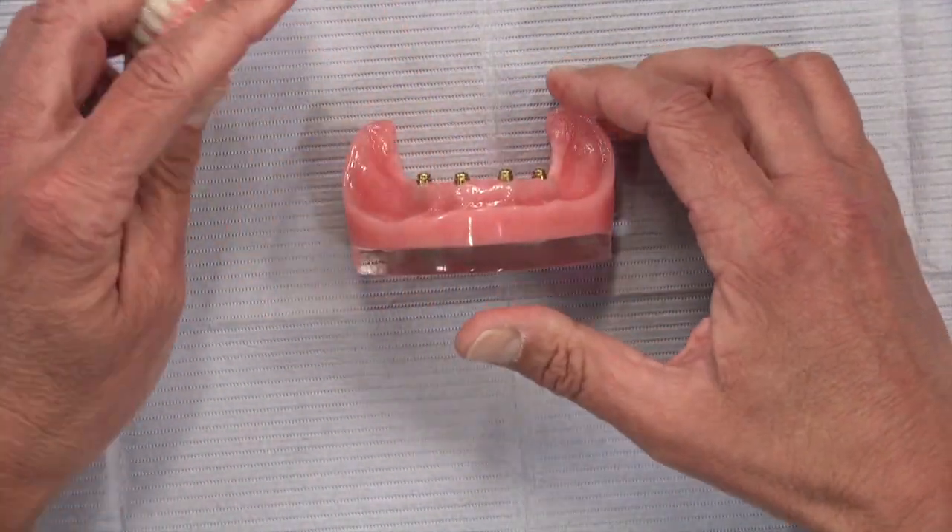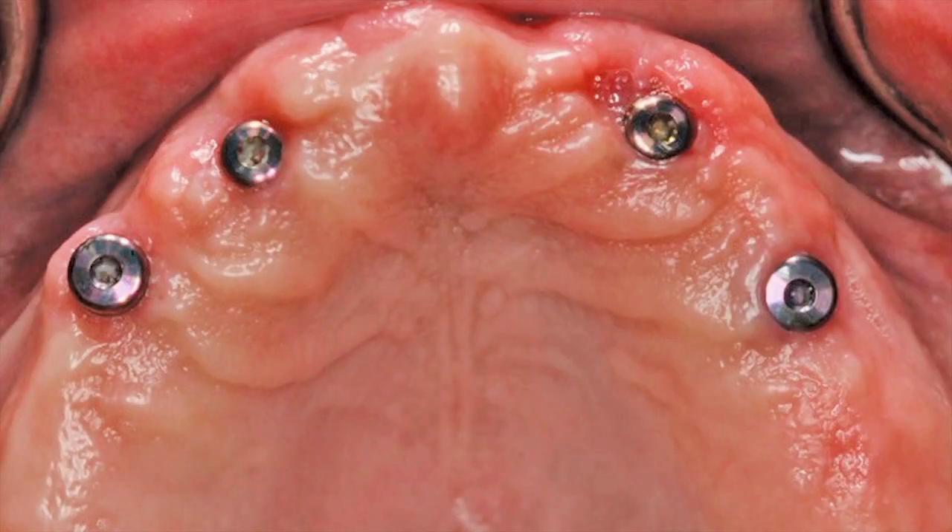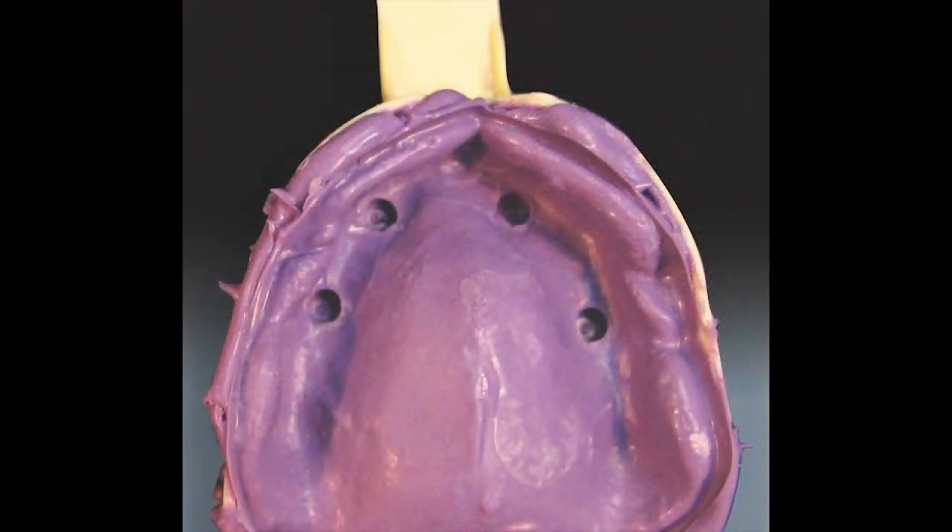So how do we get to this point? Let's look at a case. We have a patient with four implants placed, healing caps in place, and the first thing we're going to do is take an impression — really just to make a custom tray. A preliminary impression with polyvinyl using a plastic tray is fine; it doesn't need to be a metal tray. We just need to know the contours for the custom tray.